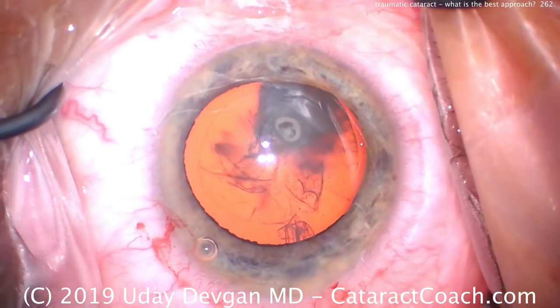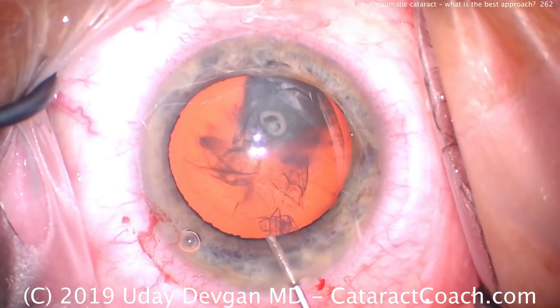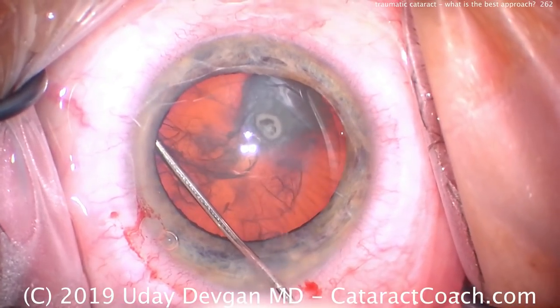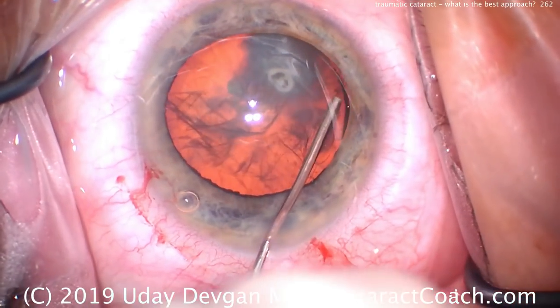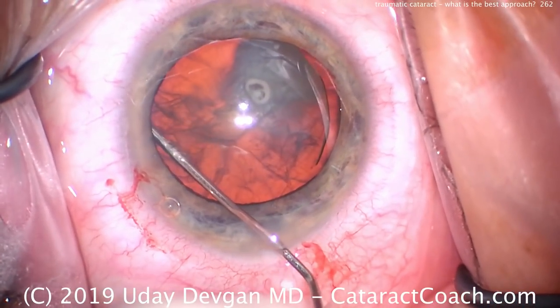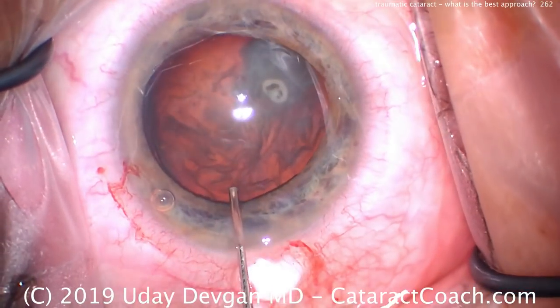Now, in hydrodissection, be very careful. Watch how the fluid waves go. Make sure there's no damage to the lens equator or lens posterior aspect, posterior capsule. So far, it looks pretty good. I want to get this nucleus out of the capsular bag completely. It's not really dense. I want it up and out of the bag.